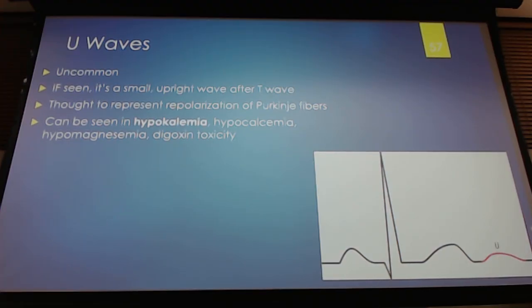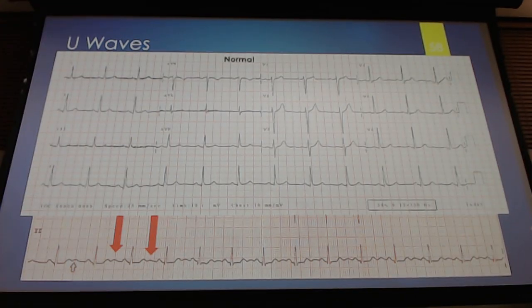Hypokalemia, hypocalcemia, dig tox. We don't see a lot of people on digoxin anymore, okay? But if you're in a position that you're going to, especially Reserve and National Guard folks, you might be seeing older patients that are still on dig. And if you do, that's an indication of dig toxicity. So this is some U waves.